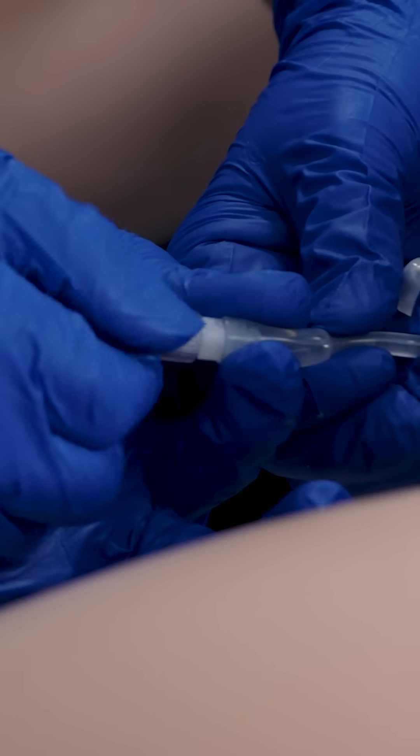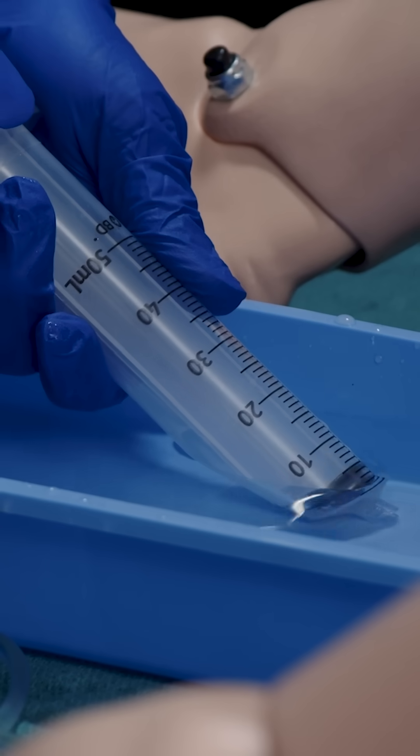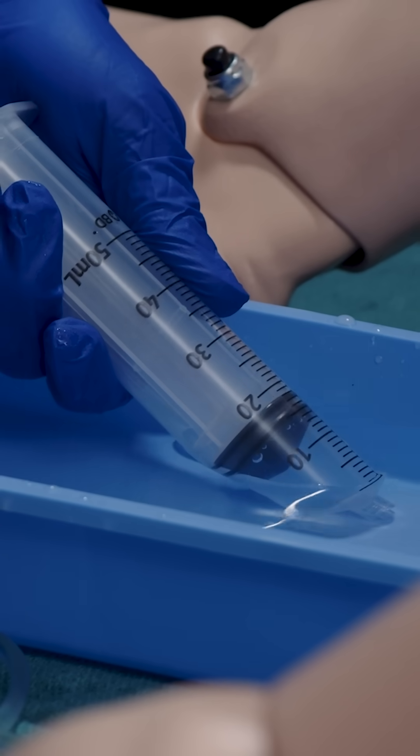There are two ways to fill a Bakri balloon. This is the manual way. Draw up 50 milliliters of sterile saline.